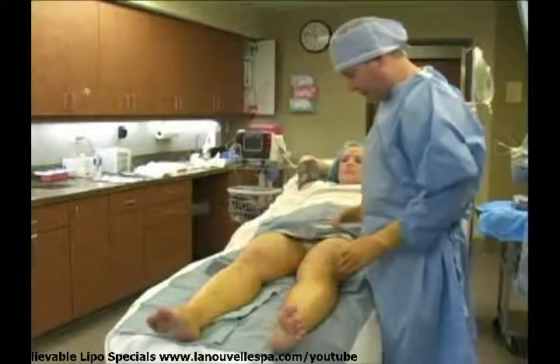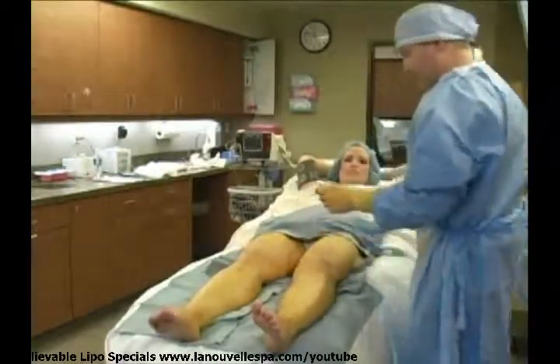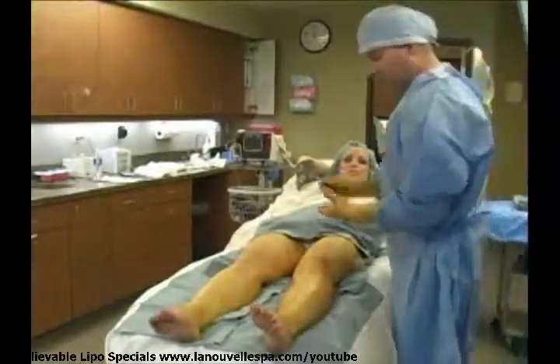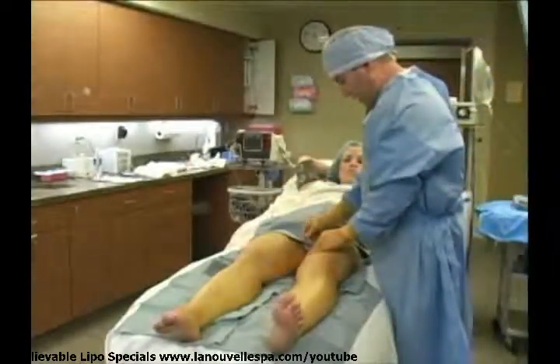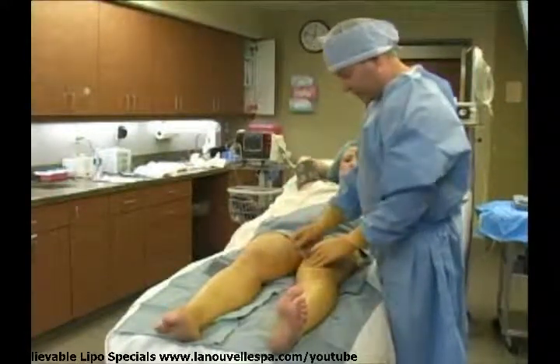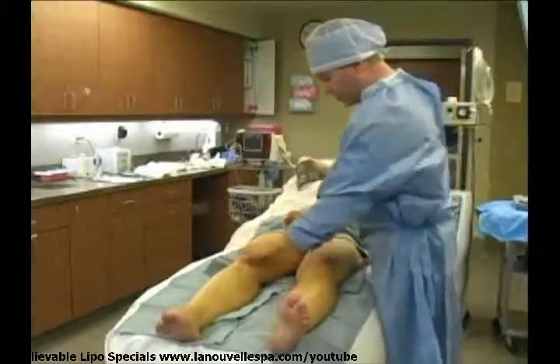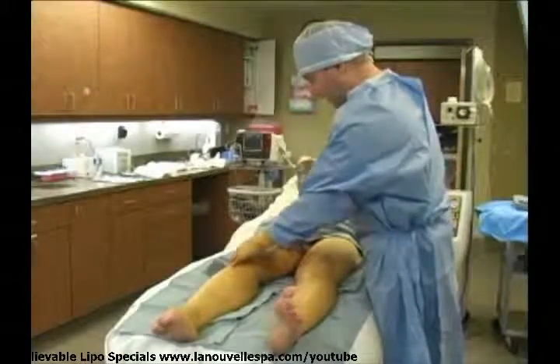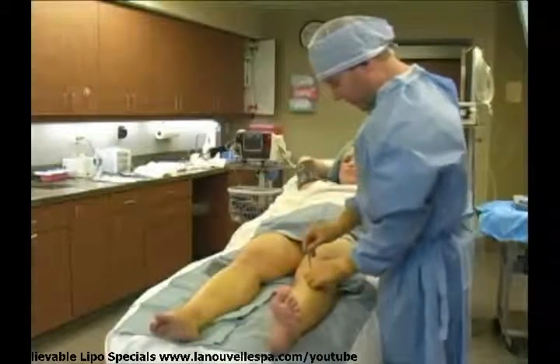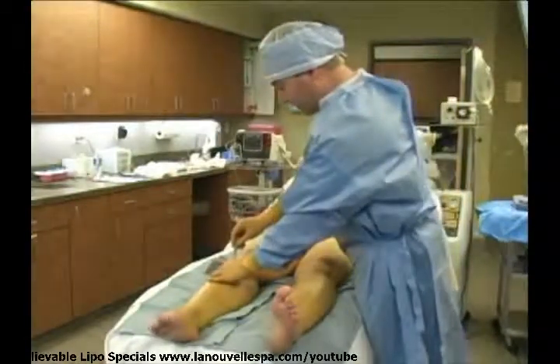The reason that we do the procedure this way is we use such tiny little incisions with this 2 millimeter punch biopsy that we can really put incisions anywhere, and they heal up so nice that 6 months to 12 months later, maybe 18 months in some cases, you'd never even know we did surgery. But it really allows us the proper access that we need to get a good surgical result in difficult areas.